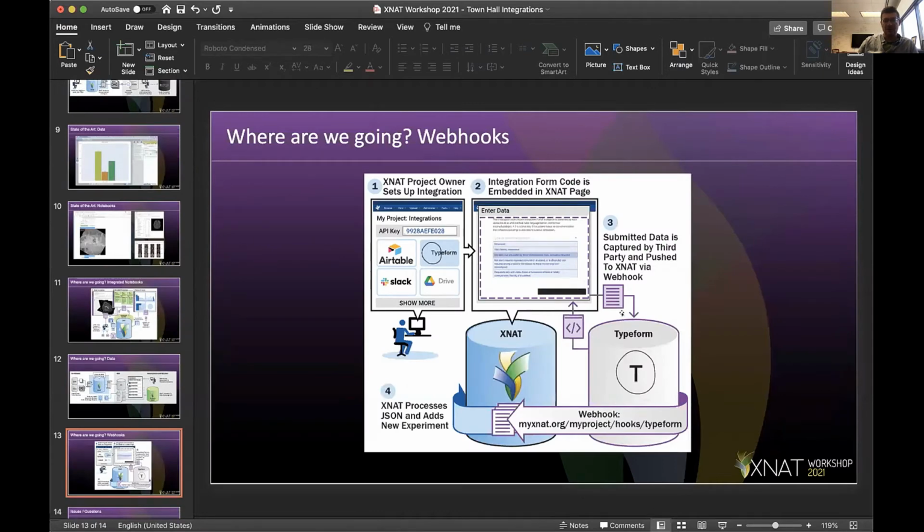I also mentioned this yesterday. I have an ambition to be able to generalize interfaces into how we talk to external applications. And webhooks is one of the interesting ways to do that. Many cloud-hosted SaaS services provide these hooks into moving data in and out of them.